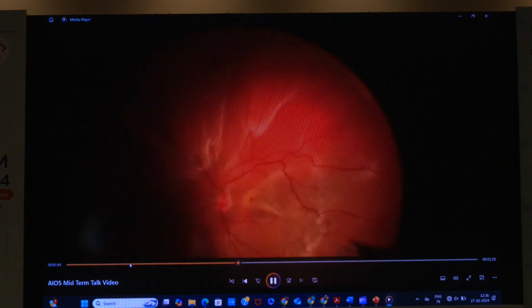If you don't, then you use a pick. You use a retinal pick. After that you do a good base excision. In this one I see that there was some more vitreous, then I have stained. Again this is helping us to improve the intraop visualization. See? The intraoperative visualization I am improving with triamcinolone.